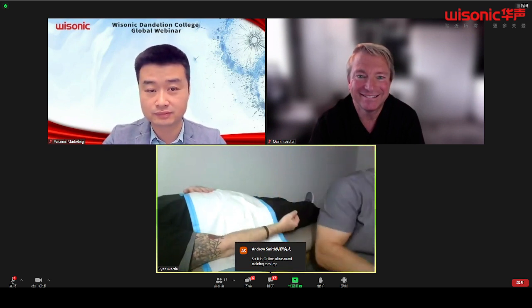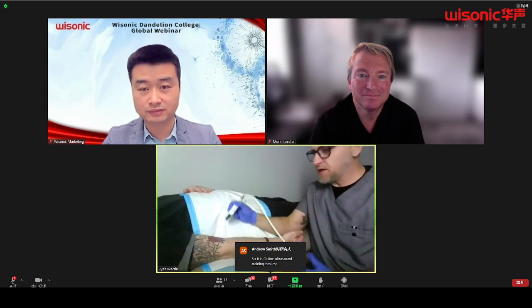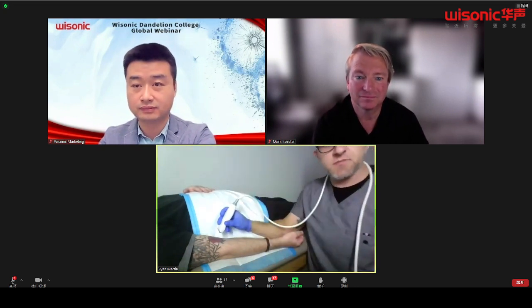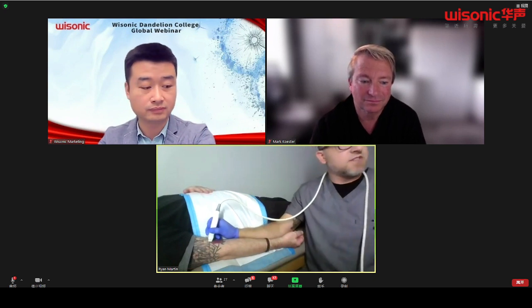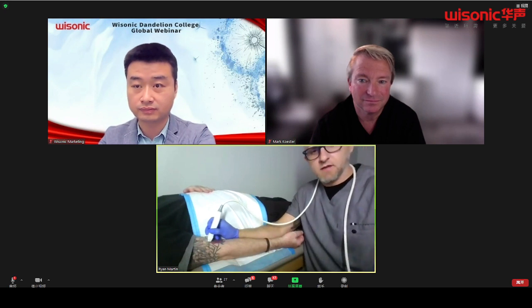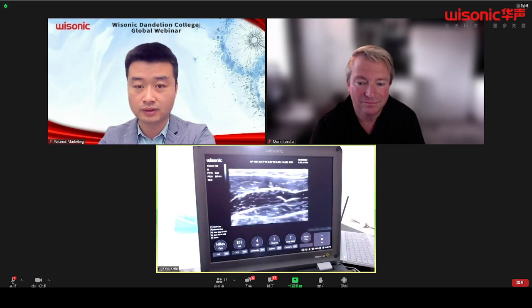All right. So from this point here, I want everybody to be able to see where my probe is here. So I tend to throw this over the top of my neck here. It makes me look cooler, but it also keeps the probe out of my face. So I'm going to show you guys 2 camera views here. And let me know how things look, okay? So here's camera 1. Here's camera 2. So hopefully that's coming out okay. Looks a little bright to me, but I don't know what it looks like on your screens.